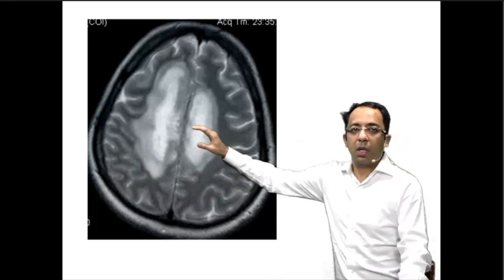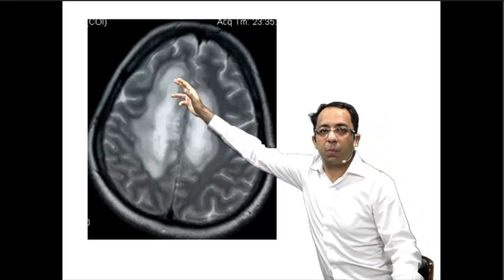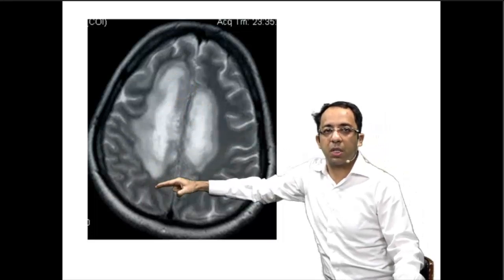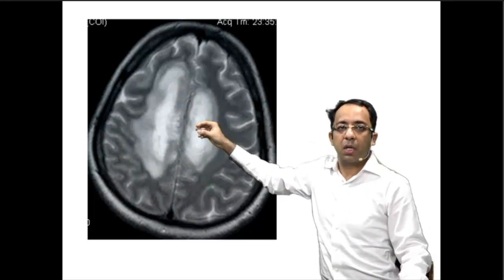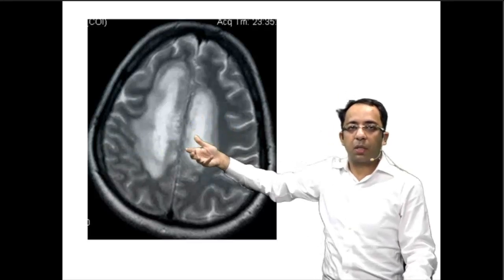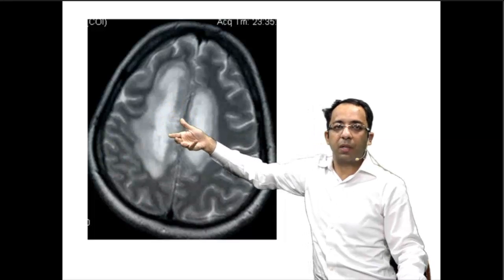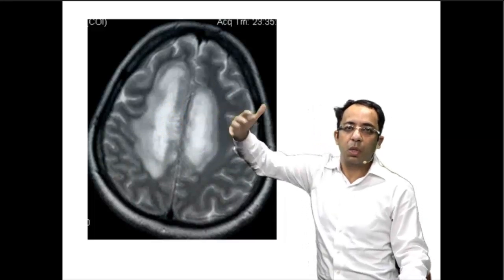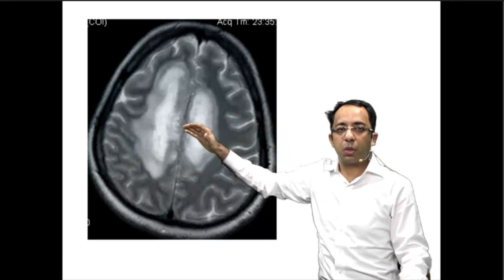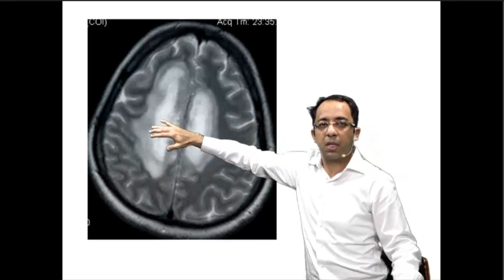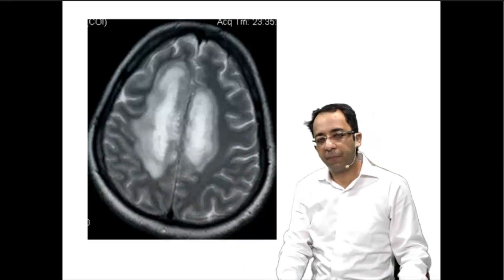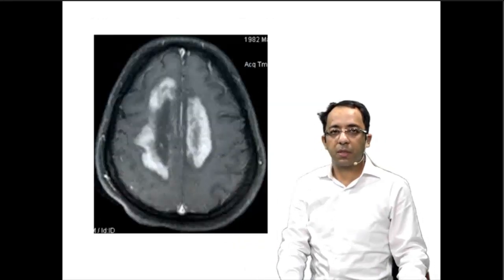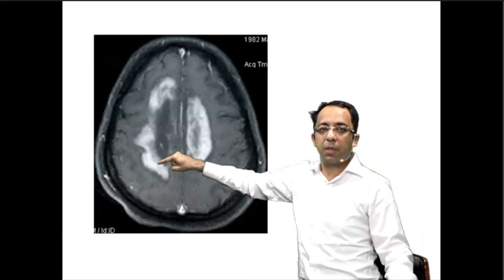In the T2 weighted MRI, in the periventricular region and in the frontal-parietal area — best described as the centrum semiovale — bilaterally you can see hyperintensity, increased signal, which is typically involving the white matter. With the neurological deficit, we correlate this as a demyelinating illness. It has bright areas and dark areas with a layered, onion-peel-like appearance. Let's look at the contrast enhanced image.